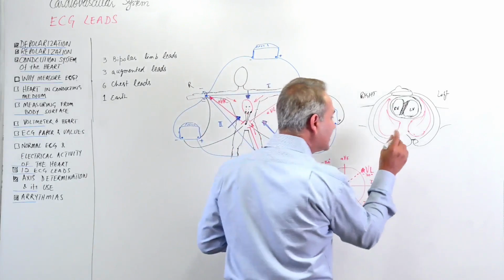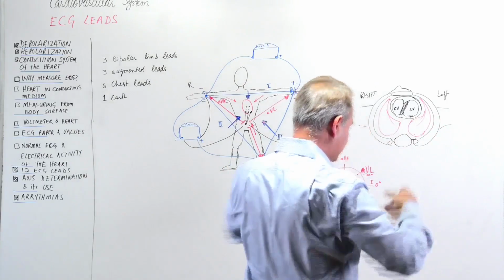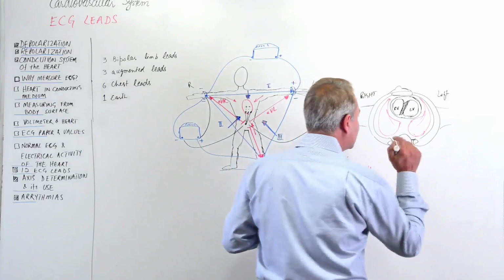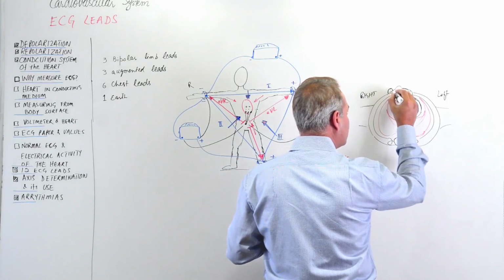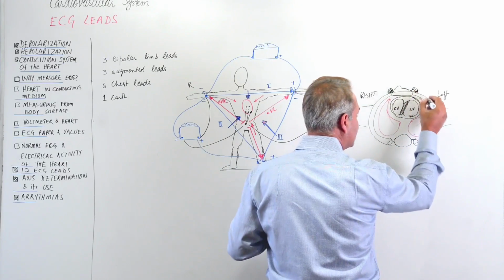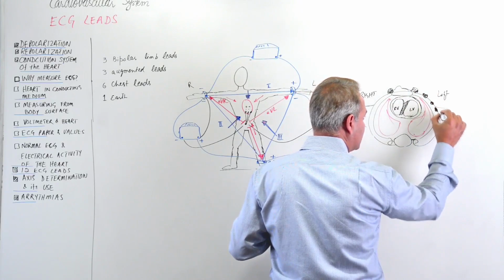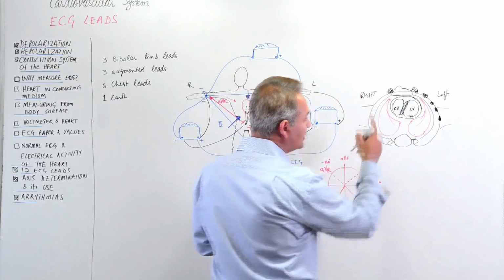It is funny. So the negative end is somewhere over here. If you bring the patient's body down near the pubis, there is a negative end. At the belly button, pubis is a little lower. So the negative end is there and positive ends are placed here. So we place one probe here, another probe here, then one here, one here, and I'll tell you about the exact placement of the views, but this is how it looks.